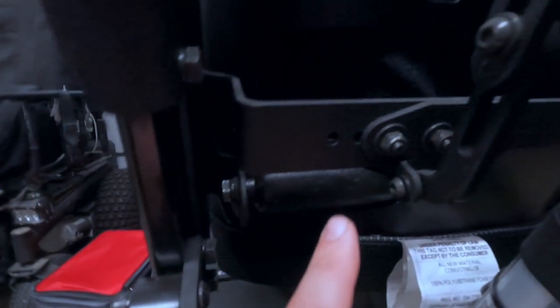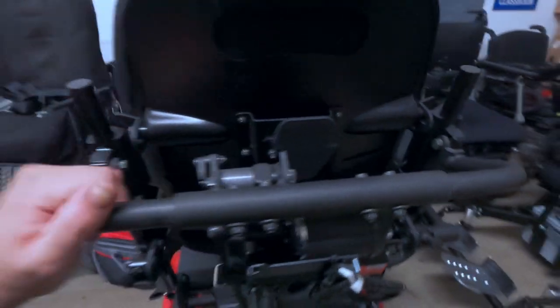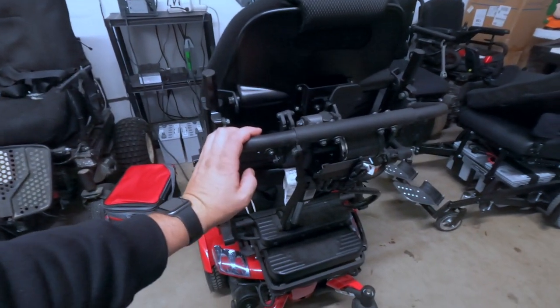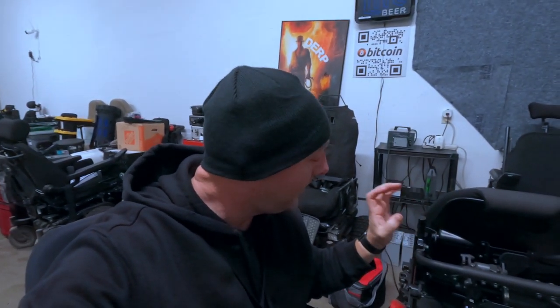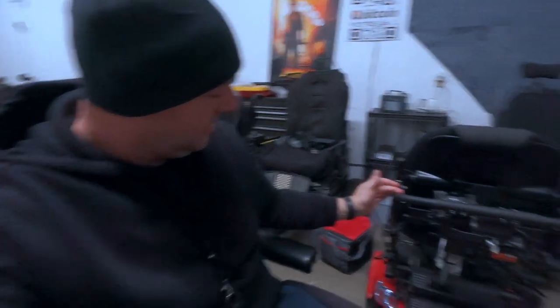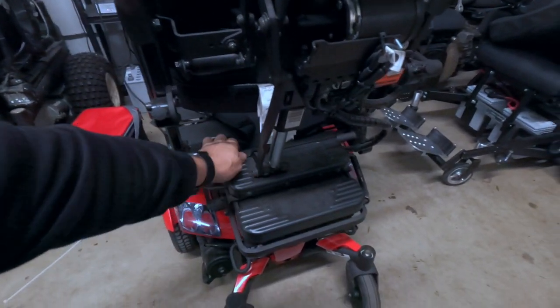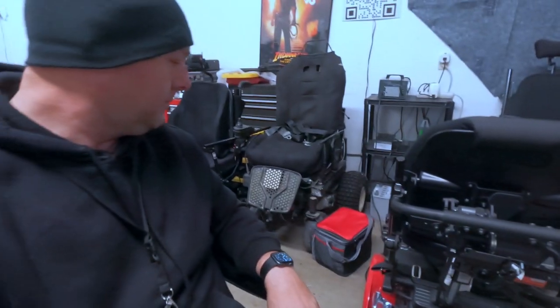There are more adjustment holes on each side. Thank you to the people that sent me info on this — I was thinking this was more complicated. I hadn't actually pulled that back cover off. This looks like standard Motion Concepts style seating, and if we pull these other covers off down here — yeah, cool. I'm going to play around with this a little bit and update you when I figure something out.